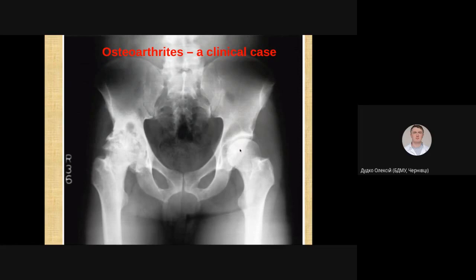If we look at the left side, we will see a more advanced stage of osteoarthritis. We can see the head of the femoral bone and the acetabulum, but we cannot find any gap between the articular surfaces. This means that the cartilage was completely destroyed.